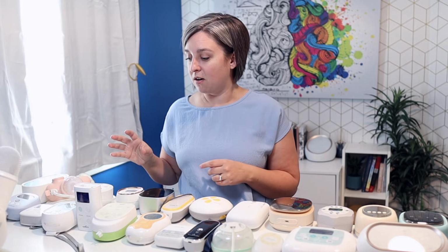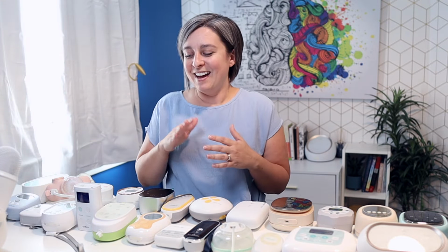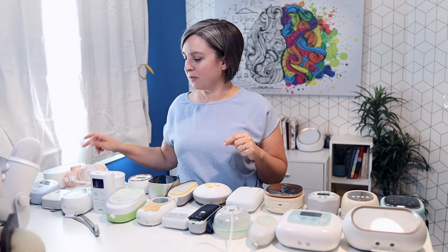A few pumps that do let you choose the cycle speed are the Ardo Alyssa. This one is very consistent and a really high quality pump. Any pumps that are dual motor will also let you, for the most part, pick a cycle speed and stay there. I'm going to have to double check some of those now that I just said that. Well, yeah, I know this one is set. I think this one is pretty set too.